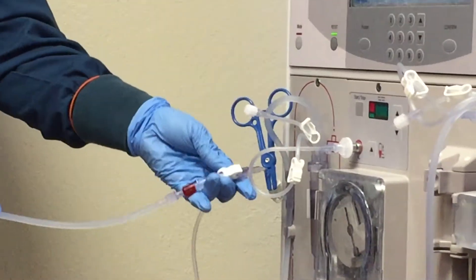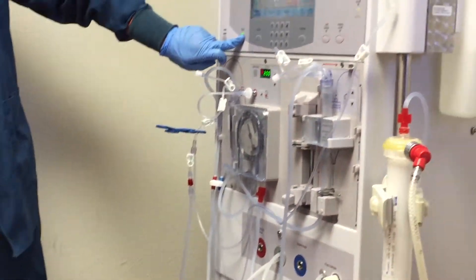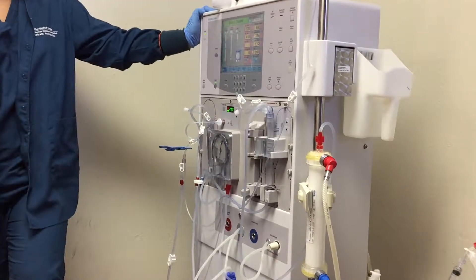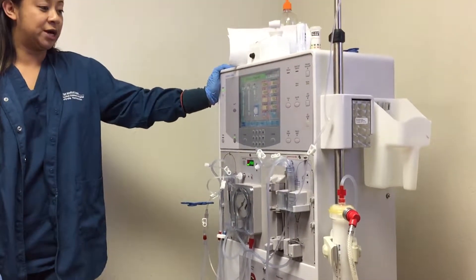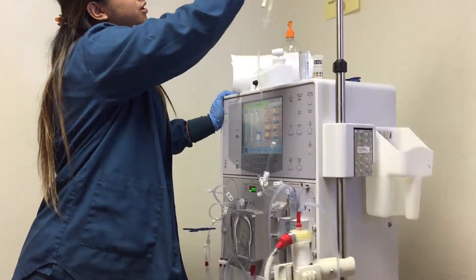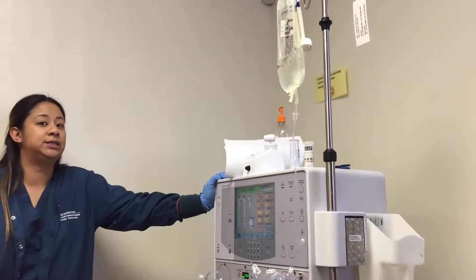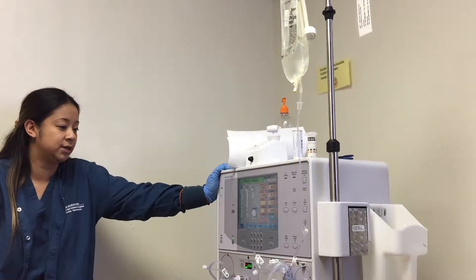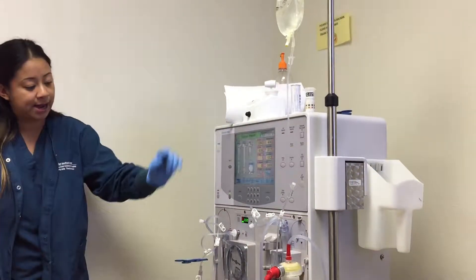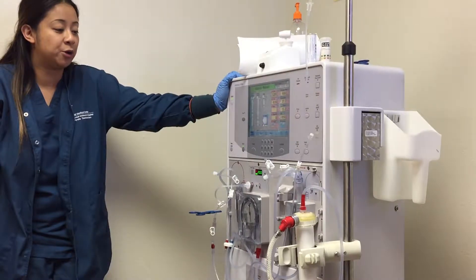You want to make sure that it's 300 cc's that you're returning back. That's our rinse back. Keep a close eye on your lines. Wait for the lines to turn a light pink, light red color.